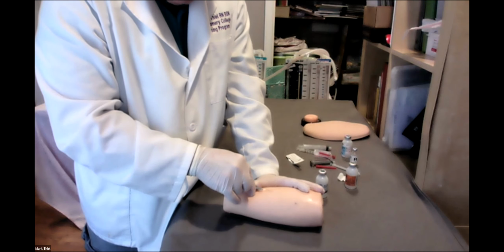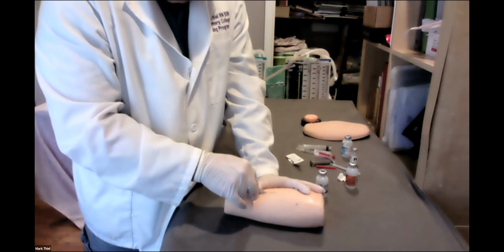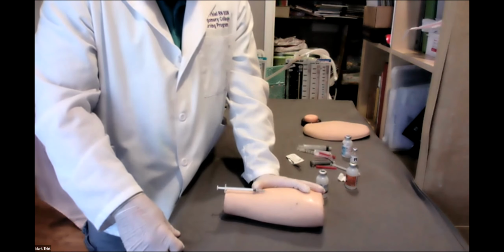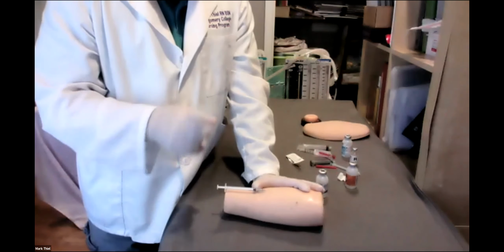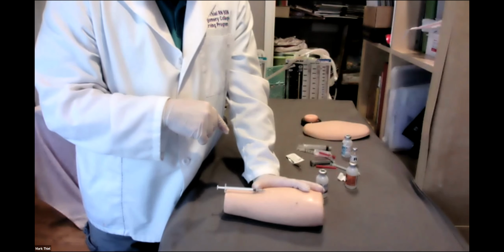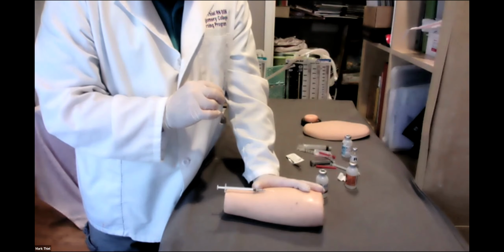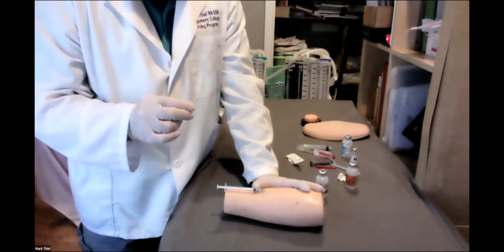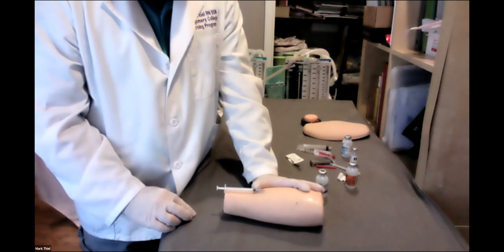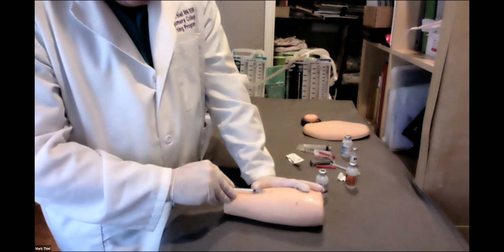Set your needle and inject just under the skin. Very tiny amount, less than 1/8 of an inch. Take a look at a traditional ruler and see what 1/8 of an inch looks like. It's tiny. But even so, visually, just under the skin. Then, what will we do?